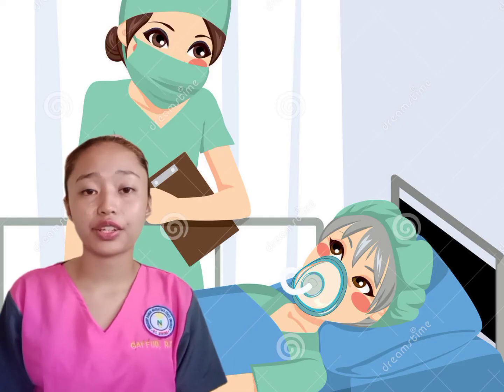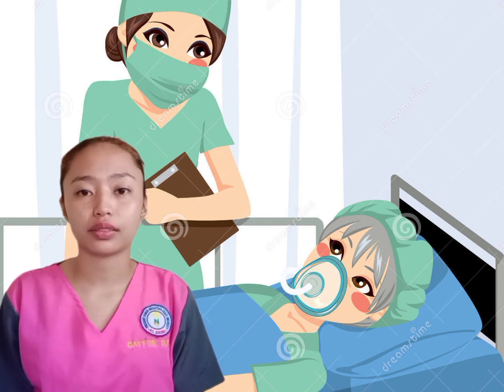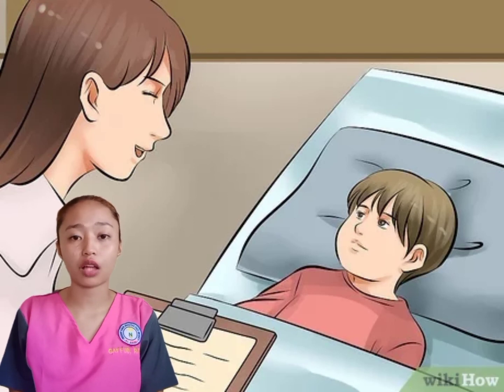Position the patient in a way that promotes comfort. Communicate a caring attitude. And then, support ventilatory effort. After that, reassess the patient's respiratory status. This indicates the patient's response to the suctioning process.